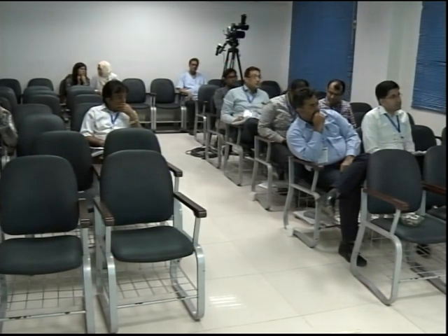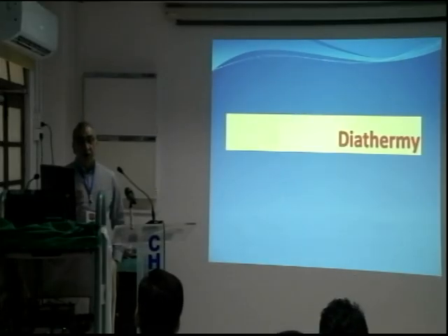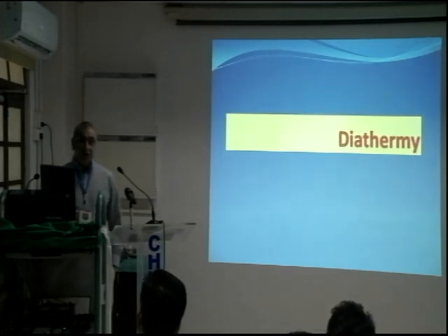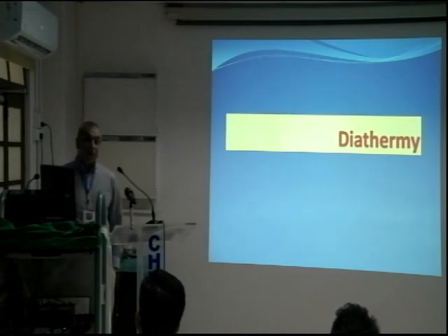Ideally, यहाँ पे जो propofol use करते हैं और US में भी propofol use करते हैं, अमेरिका में. ब्रिटेन में हम routinely नहीं use करते, लेकिन I come from a very big department where we do over 1,500 ERCPs a year. So I have a GA list once a month. In fact, I'm trying to do that twice a month. जो patient tolerant नहीं होते हैं, जो complex procedure होती है ERCP में, those I do under GA with full intubation and proper general anesthesia. But generally in UK we use combined sedation.